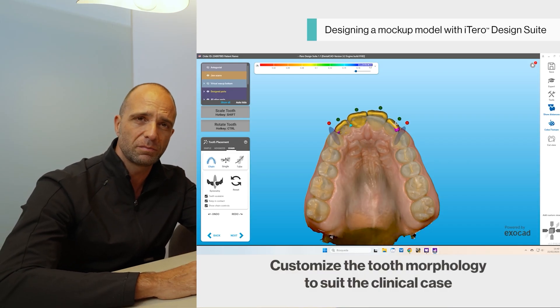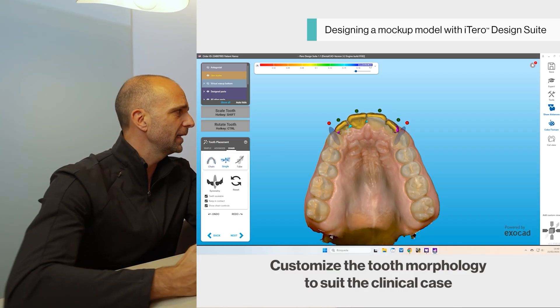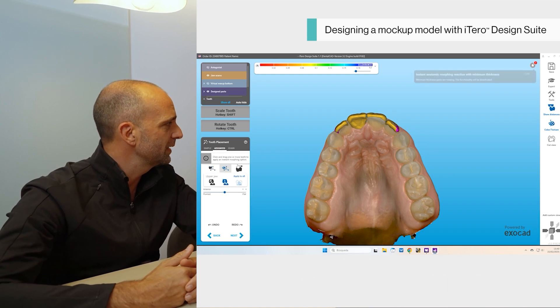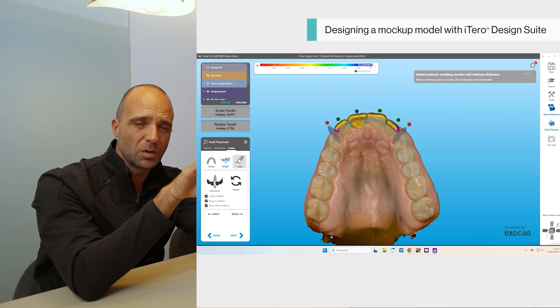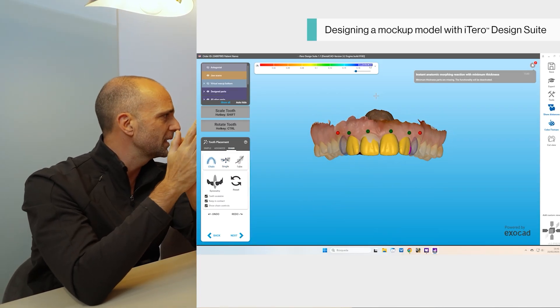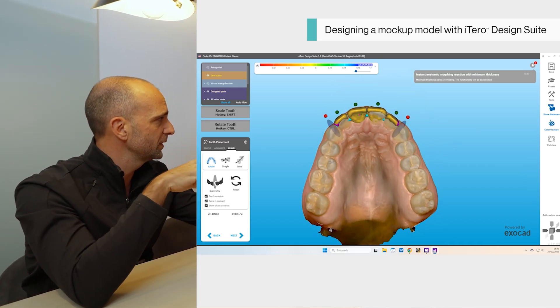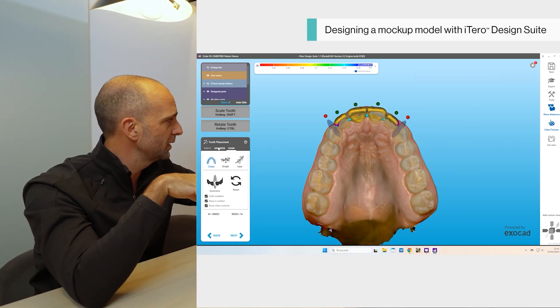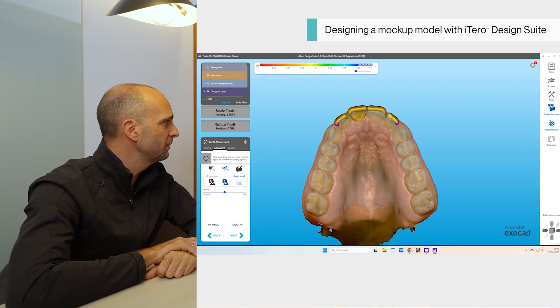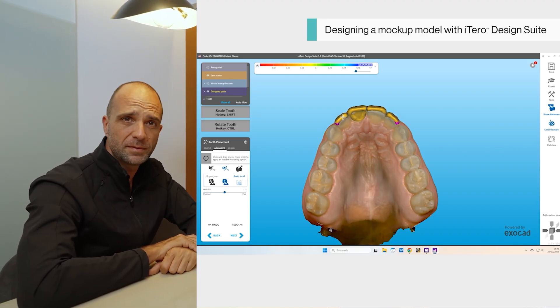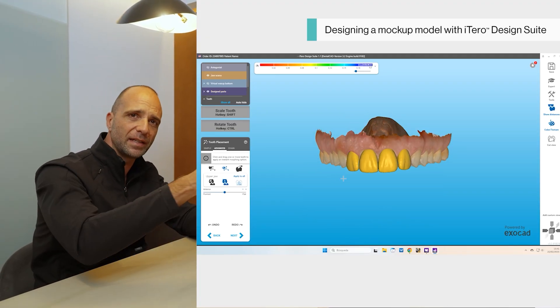We remove the antagonist and do the adaptations on the buccal surface. This will be a motivational mock-up — an adaptive mock-up that will be slightly over the patient's anatomy. Unlike the clip-on version, here we don't need connectors. We just need to readapt the buccal surface of the centrals and laterals slightly, to ensure that everything fits in terms of the shapes and forms you want before transferring into the patient's mouth with the silicone index.